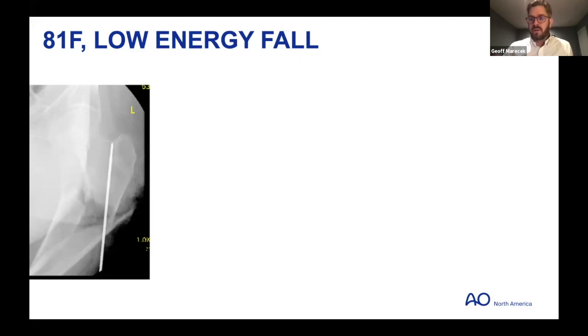You can see she has a really capacious canal, and if you leave it with that long butterfly piece down the shaft, you're going to have really poor fit in the proximal segment that we know is difficult to control. You're going to have a really long working length, and then you're going to pretty quickly transition past the isthmus into the capacious metaphysis.